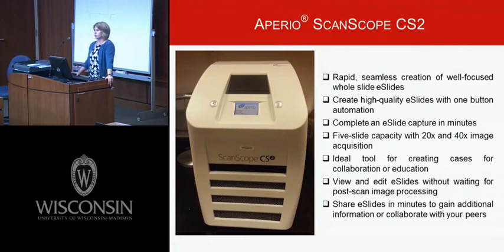Before we get into the imaging modalities, we have a new piece of equipment within the TRIP laboratory, the Aperio ScanScope digital slide scanner. It is a rapid and seamless platform that allows you to image whole slides. It's automated and can capture the image within minutes. It's automated at present for up to 5 slides, and they can acquire these images at 20 or 40x magnification.